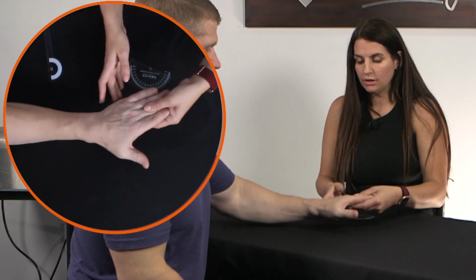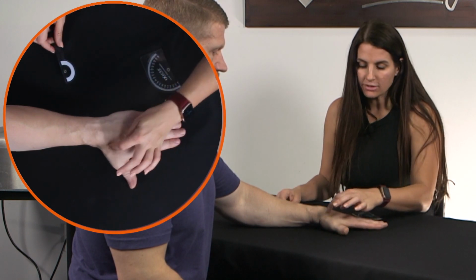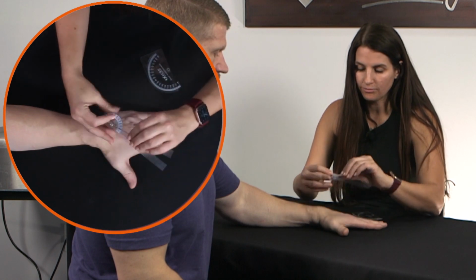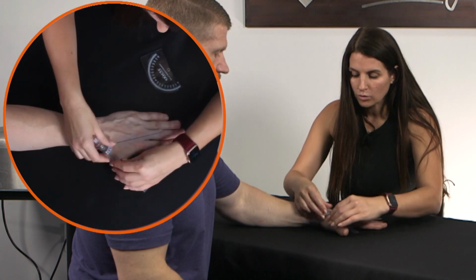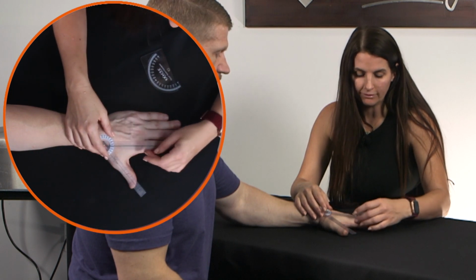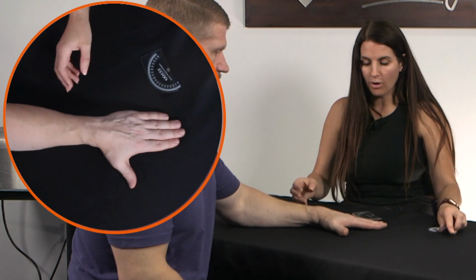Now for doing radial abduction, you lay them flat and bring their thumb out. Same thing, you find the base of that joint, the CMC joint, and you line it up with the metacarpal of the thumb and the metacarpal of the index finger. And that's how you perform radial and palmar abduction.